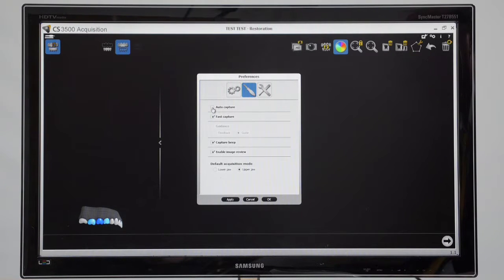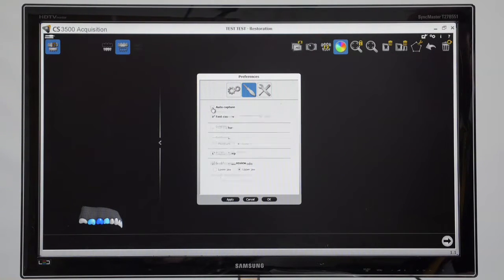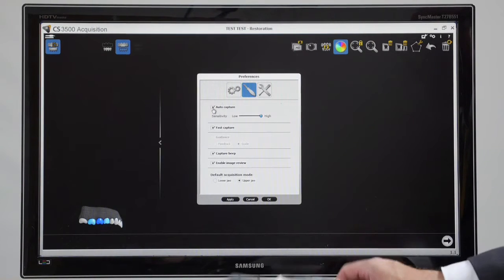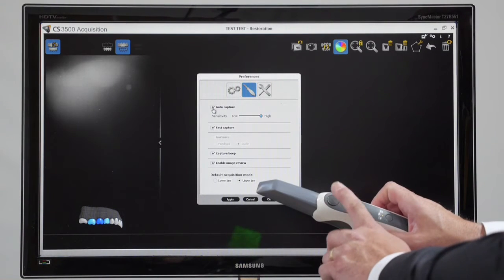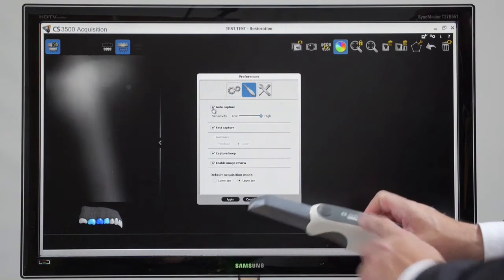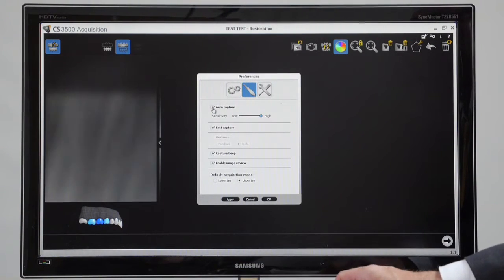You have the facility to take that off, though, if you wanted to just use the button of the scanner to do your scanning.